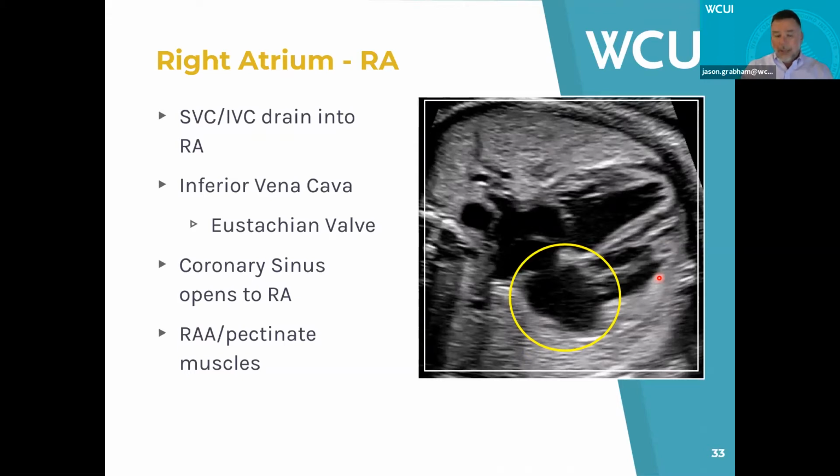And that's something that you can see from a four-chamber view. And again, some of these points we're talking about, we're obviously not going to see the SVC, IVC entering the right atrium in a typical four-chamber view. But as you put this together as part of your comprehensive exam, those are great anatomic markers to look for as you go forward.